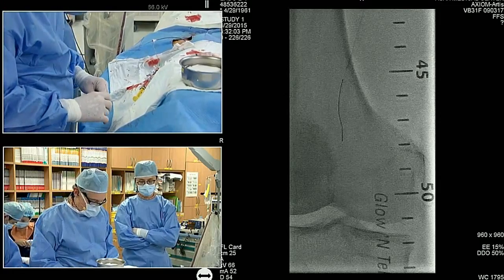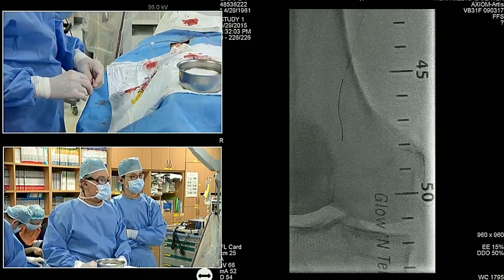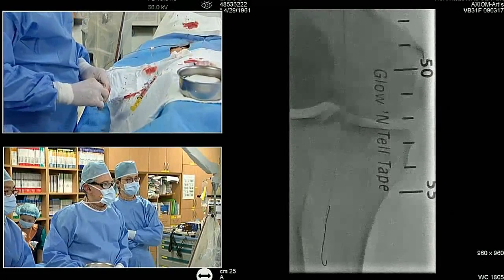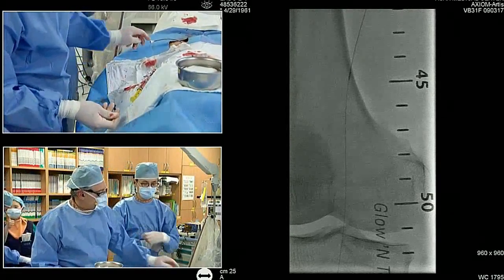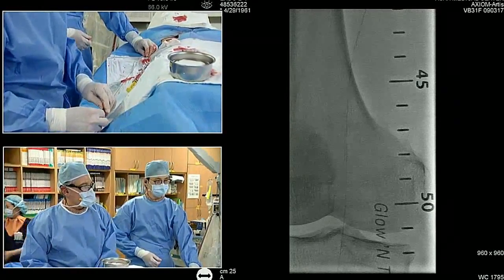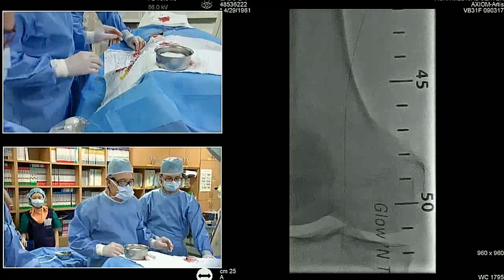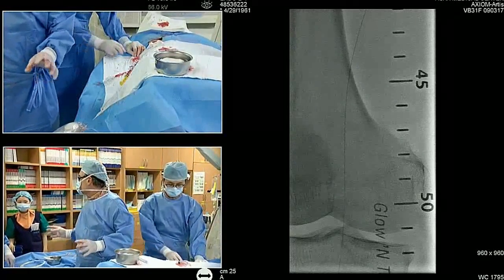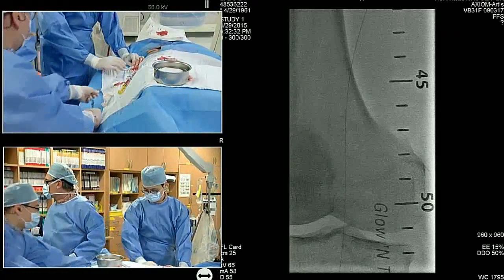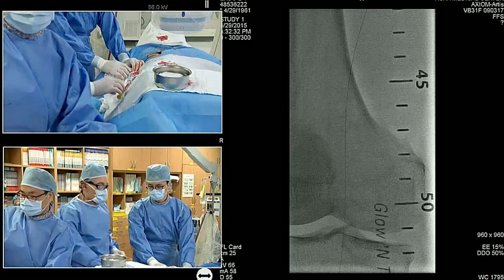Well, okay, the operator's here. We've been working away, so we haven't really discussed how to finish. I would agree that probably stenting's a good idea for long-term patency. So we'll exchange out the CXI, and then we can discuss. I think we balloon first, see how it looks, and then decide. So what's our longest 014-based balloon? 014, 018. Just go ahead and prepare like a 4 millimeter diameter. Long, I would say a long 4 millimeter.